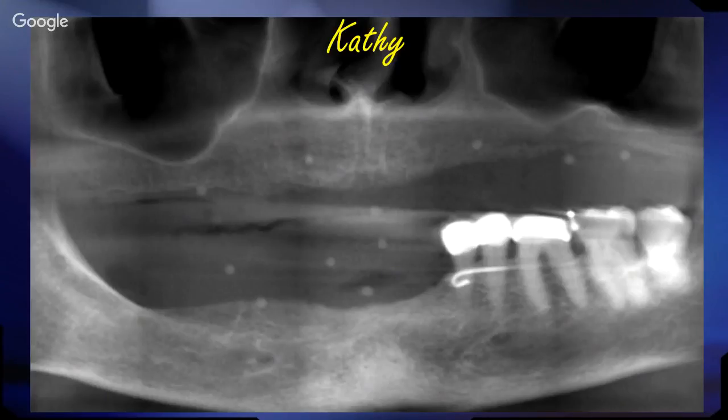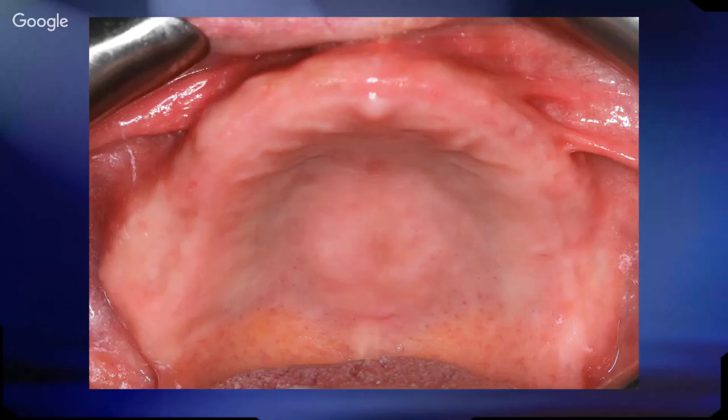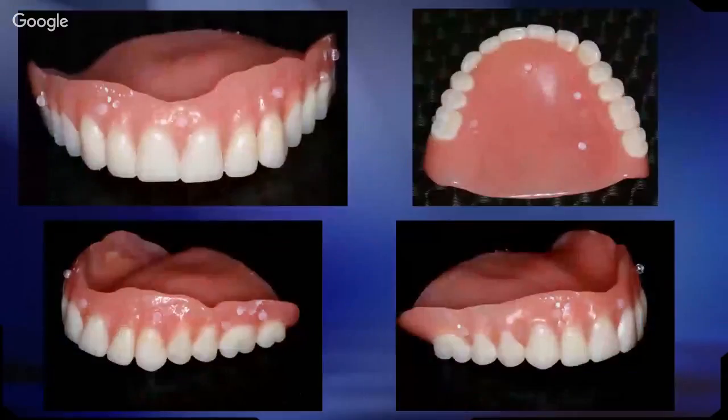So we scan the patient with the dentures in the mouth. Here's what the patient looks like. Here's the denture. In our case, we actually glued the glass beads to the denture. We find that they stick on really well. Now, people are also concerned about damaging the denture. These pop right off, and then you can polish up the denture. But most of the time, you're converting these patients to a fixed prosthetic anyways, or making them a new denture. So it doesn't really matter, even if the denture gets a little bit damaged. But we haven't had any issues with the denture getting damaged. But you can see where we put the glass beads on the palate and outside.